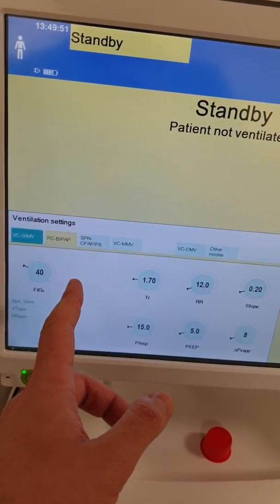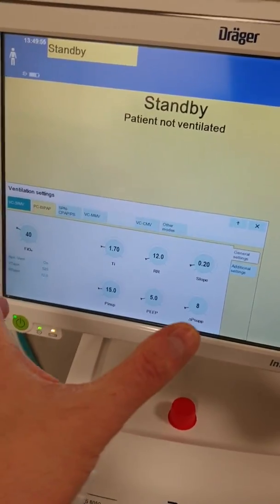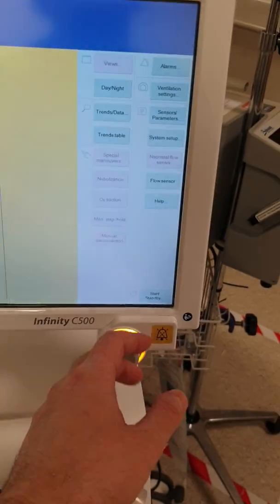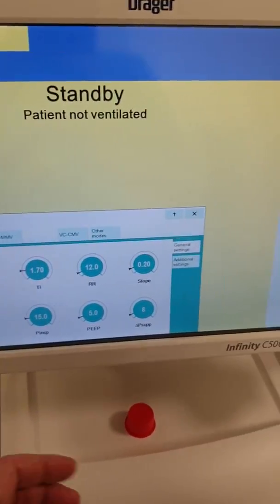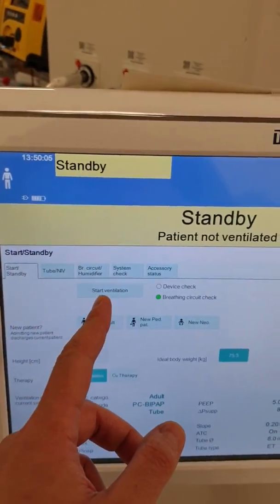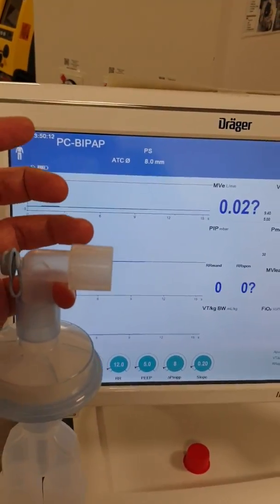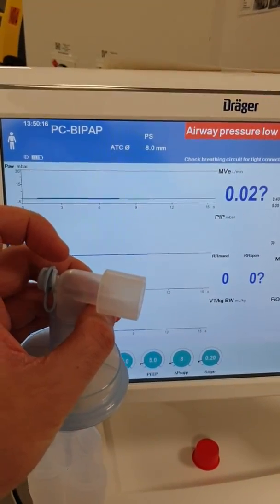For example, if you go here, which is pressure control BIPAP — which is actually a bi-level — let's say we want these settings. We confirm, then close the window, and start the ventilation by confirming. So that's a quick idea about how to connect, how to do the checks, and how to connect it to the patient.